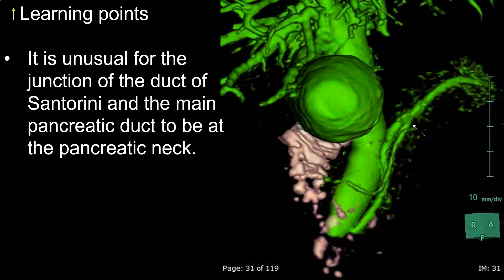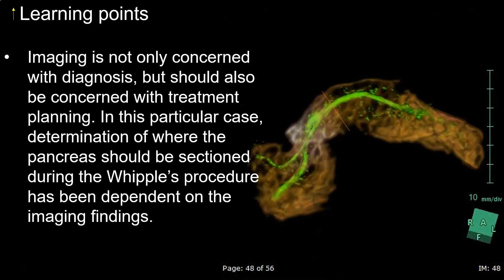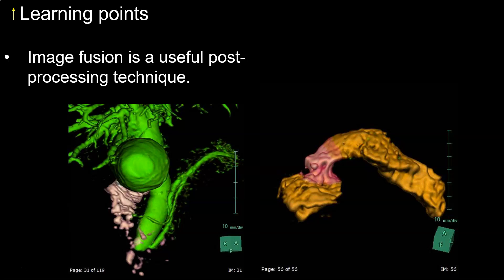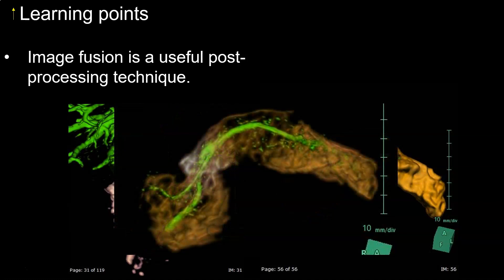It is quite unusual for the junction of the duct of Santorini and the main pancreatic duct to be at the pancreatic neck. Imaging is not only concerned with diagnosis but should also be concerned with treatment planning — in this particular case, determination of where the pancreas should be sectioned during the Whipple's procedure was dependent on the imaging findings. Image fusion is a useful post-processing technique: the junction of the anomalous ducts is well seen on the MRCP but the pancreatic parenchyma is not, and the pancreatic parenchyma is seen on the T1-weighted MRI but the pancreatic duct junction point is not seen — so image fusion could solve the problem.